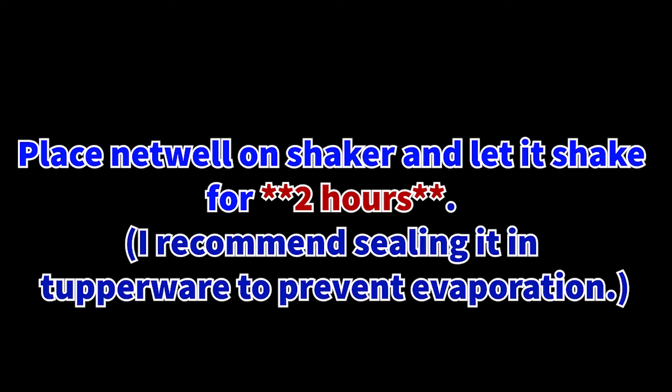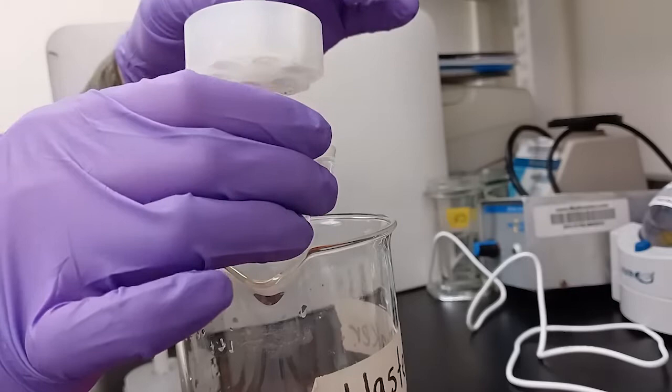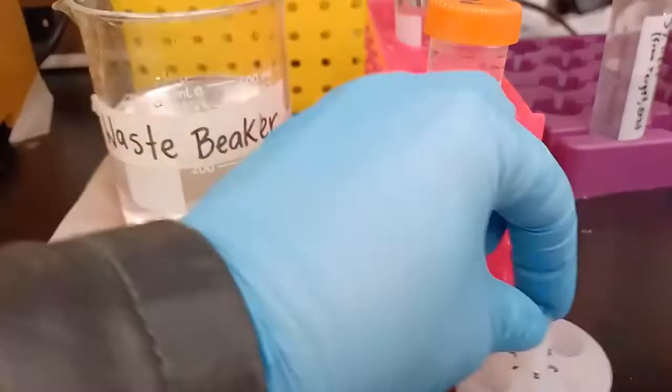Place the netwell on the shaker and let it shake this time for 2 hours. It's okay if it goes a little over 2 hours, but 3 hours might be a bit long — aim for 2 hours. I recommend during this time sealing the netwell and basin in Tupperware in order to prevent evaporation of the solutions. After the 2-hour secondary antibody incubation is complete, we will discard the solution as waste. Unfortunately it cannot be salvaged, as it does not keep for very long. Rinse off the secondary antibody residues with another round of 3x5 PBS rinses.